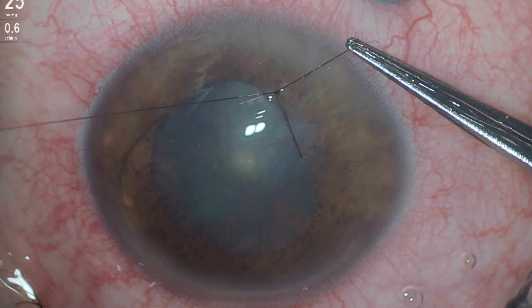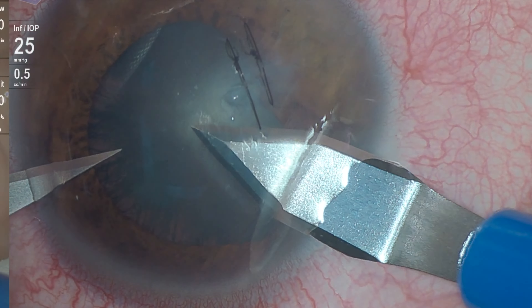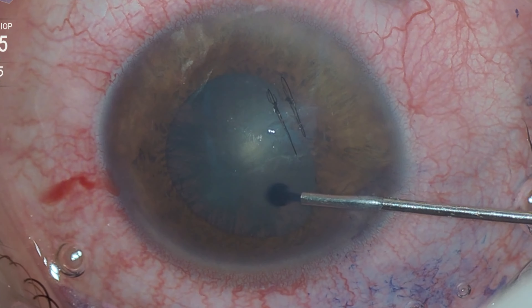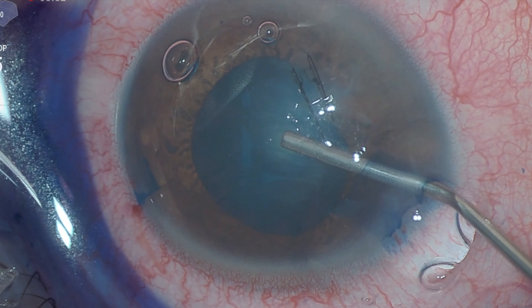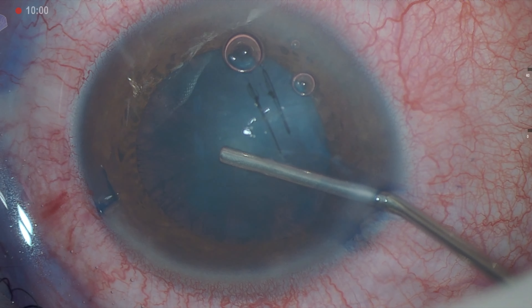The main and accessory corneal incisions are made simultaneously. Trypan Blue is used to stain the anterior capsule of the lens and facilitate identification of the entry point of the foreign body, where we will initiate capsulorexis.